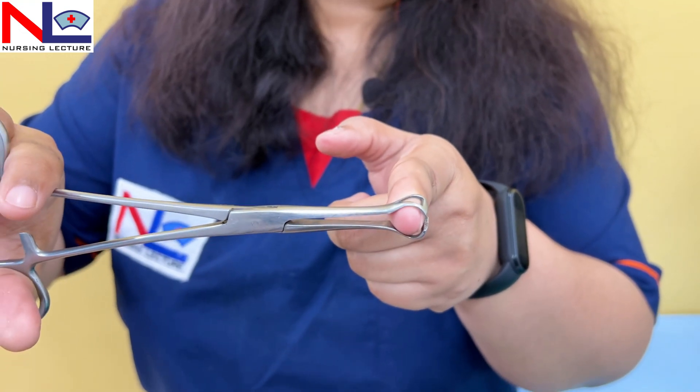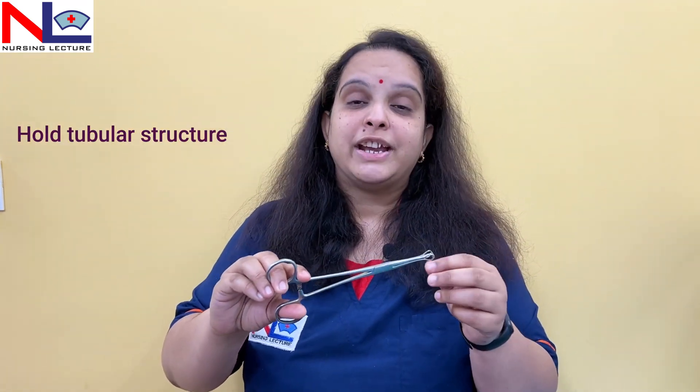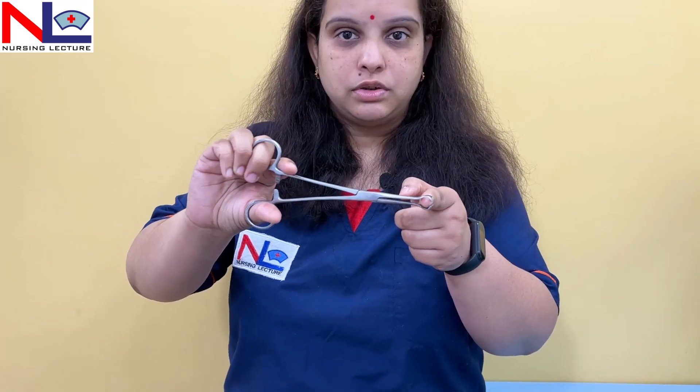The fenestrations allow the tissues to bulge out through them — this instrument does not crush tissues but holds tubular structures gently. In tuboplasty, where we repair the fallopian tube or check its patency, we can use the Babcock to hold the fallopian tube. In radical hysterectomy, where we remove the uterus and parts of the reproductive organs, it is used to hold lymph nodes. We can also hold the appendix and ureter with this instrument.